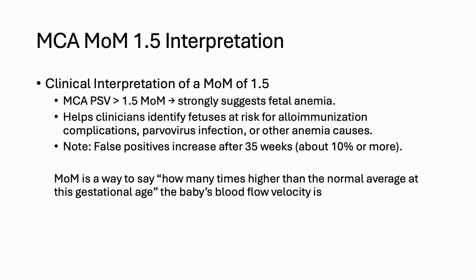False positives do increase, like I mentioned before. So a good way to say this is the MoM is how many times higher than the normal average at this gestational age the baby's blood flow velocity is.